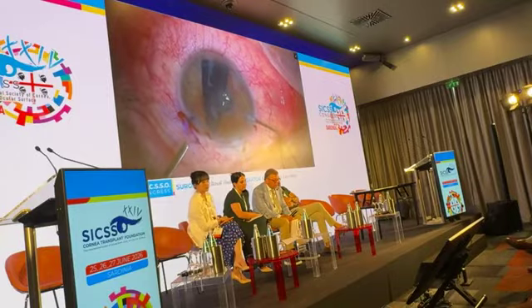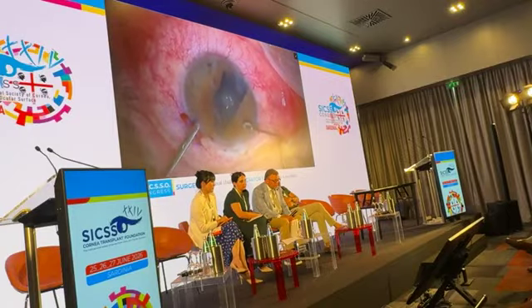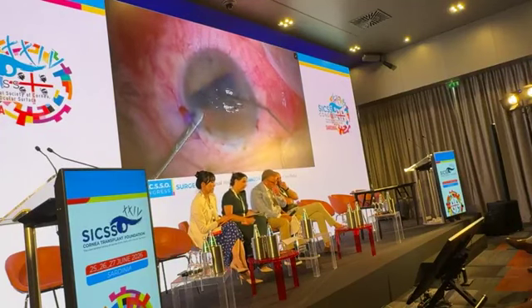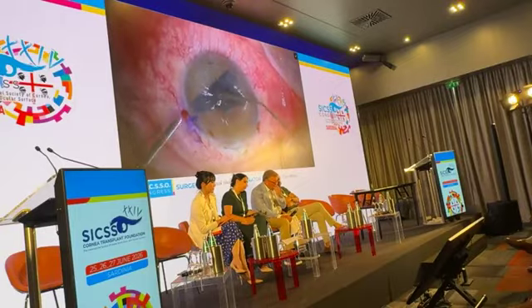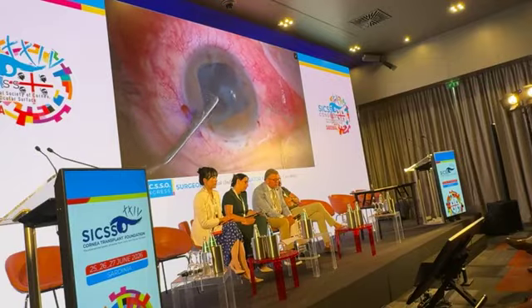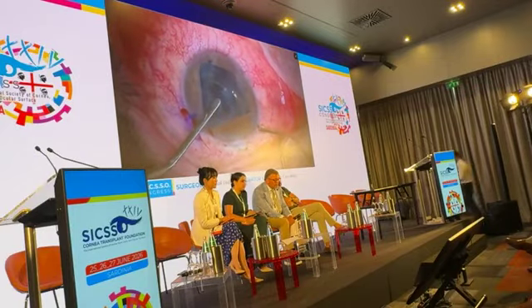We should be already in the correct orientation of the graft. It's very important when injecting the graft that he pays attention to the position of the graft in the injector. Wet the cornea. We are well centered now with tapping maneuvers. Hopefully we'll manage to unfold the graft.